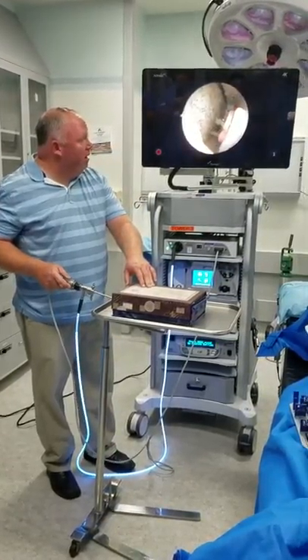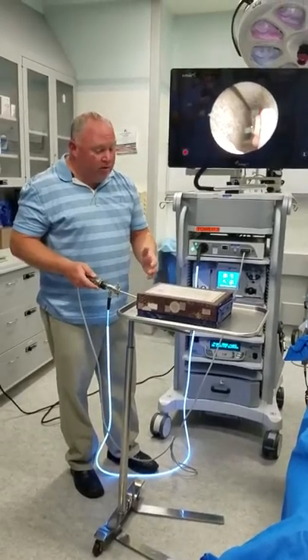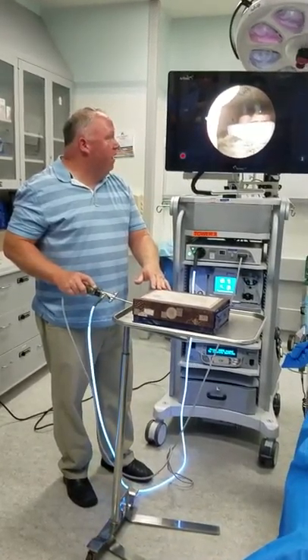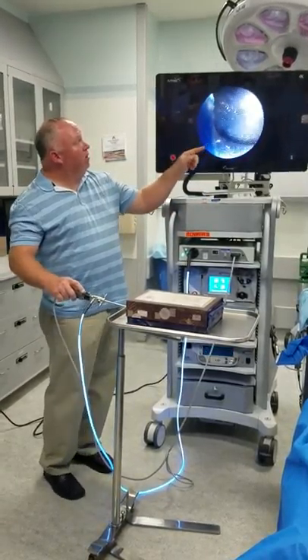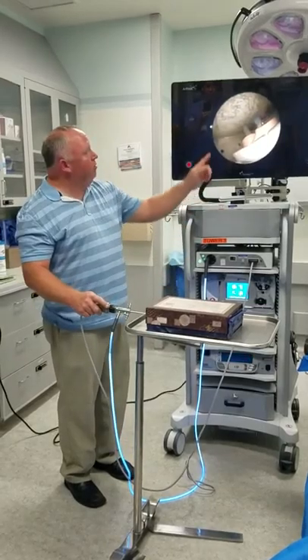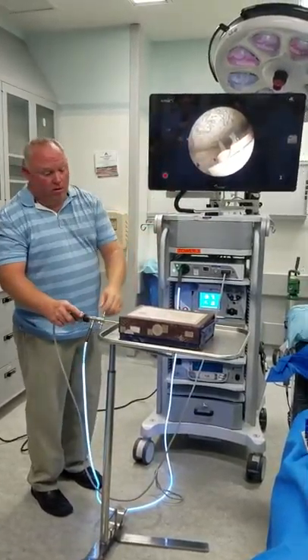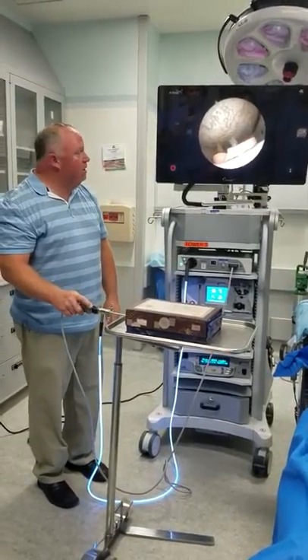So hopefully in your body you don't have Styrofoam. Hopefully. I know what's inside here, so I know what's kind of up, what's down, okay? That being said, like I told you, this little arrow here is telling you where the angle of the scope is. Okay? That makes sense to you. So the scope is sitting up, kind of where I'm at here.